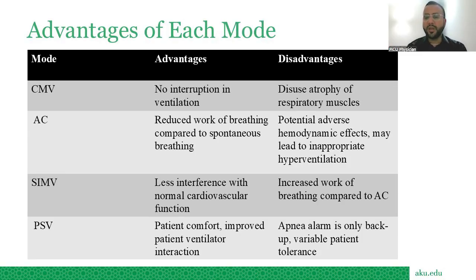Okay, coming to the advantages of all of these modes. Just before I discuss this slide, I'll give you a very easy concept to make it easier for you to understand. The higher the control with the machine or ventilator, the less the patient's muscles are used. The higher the machine control, the smoother and more guaranteed the breathing will be.